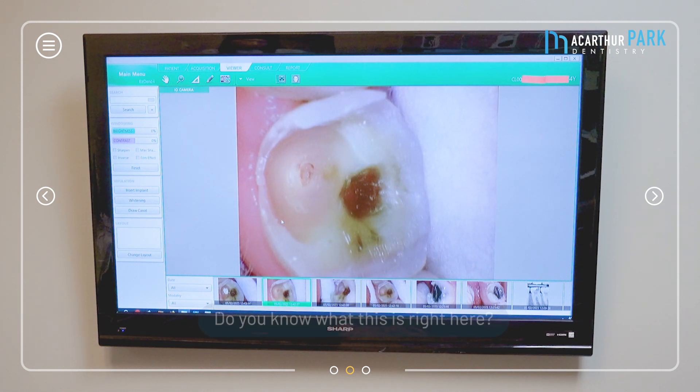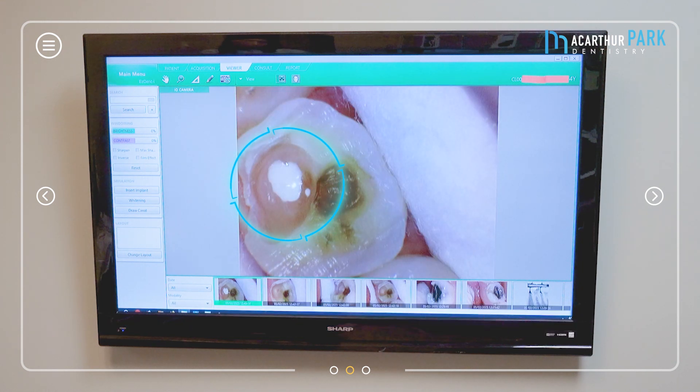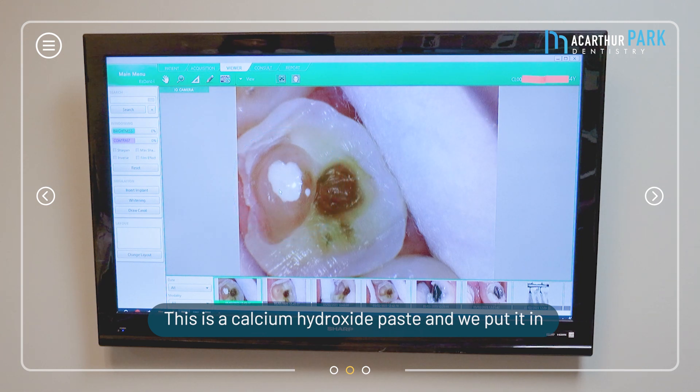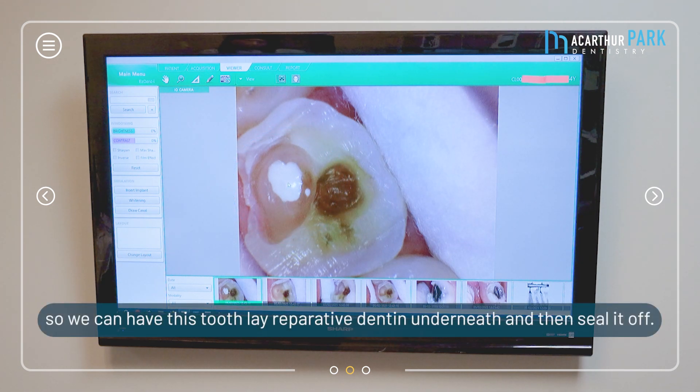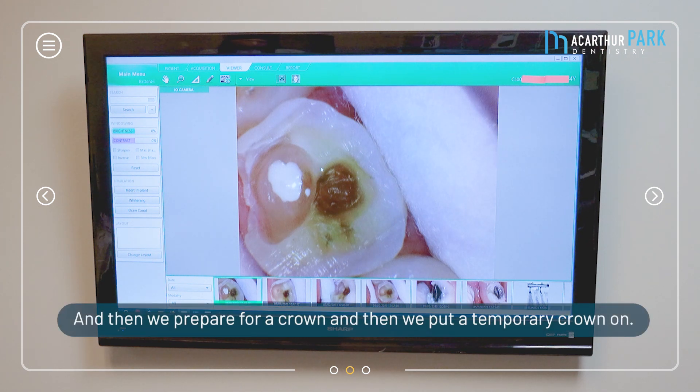Look at this — do you know what this is right here? This is called the root canal, actually the pulp chamber. Since it wasn't bleeding and he didn't have any symptoms, what we did was place a calcium hydroxide paste barrier to block it and give the tooth a chance to lay down reparative dentin underneath and seal it off. We gave it a chance, but there's still a chance he may need root canal therapy. We then prepared for a crown and put a temporary crown — this is an ongoing case so we don't have a final result yet.